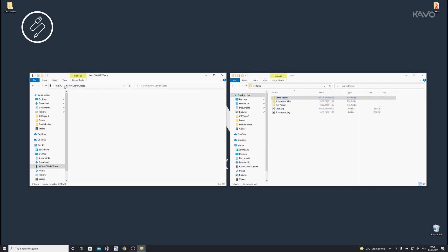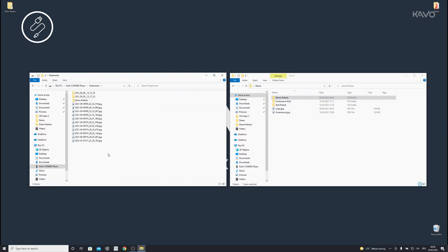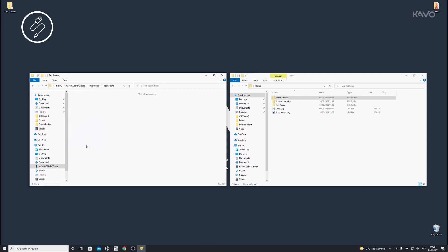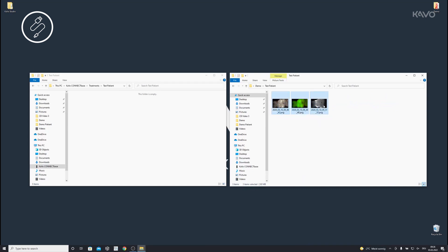The import of data follows the same functional principle as the export. Open the Carvo ConnectBase drive on the computer. To import treatment data, open the Treatments folder and copy your desired images or subfolders to the Treatments folder. You can choose any names you like for the subfolders and images within the Treatments folder.